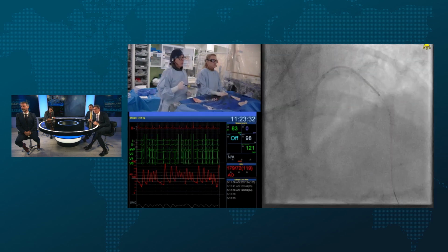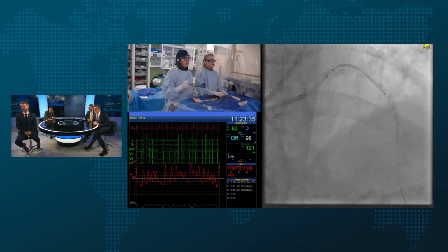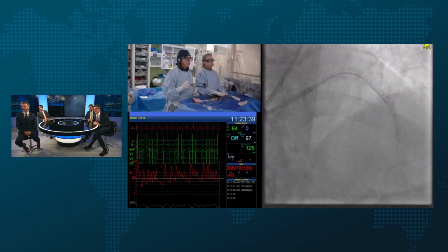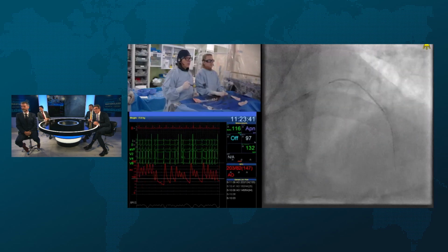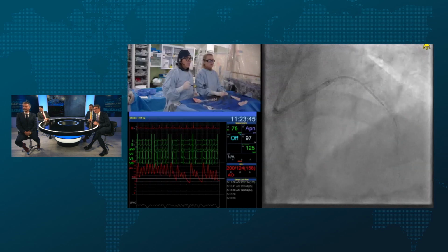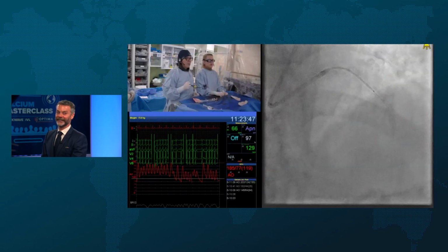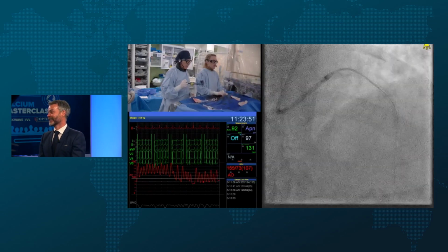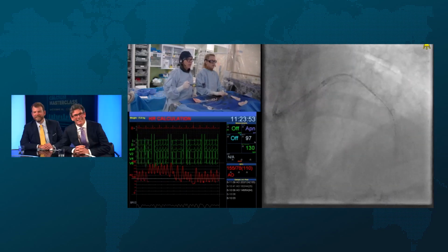There you go. It's probably because of that guide extension. Honestly, good move. Put the guide extension back in. This is a 38 as well, just for Jonathan's sake. So he's missing 10 millimeters of stent here. So we're going to back up until we minimise our overlap and then just check where we land. It's the subplot of the calcium masterclass.